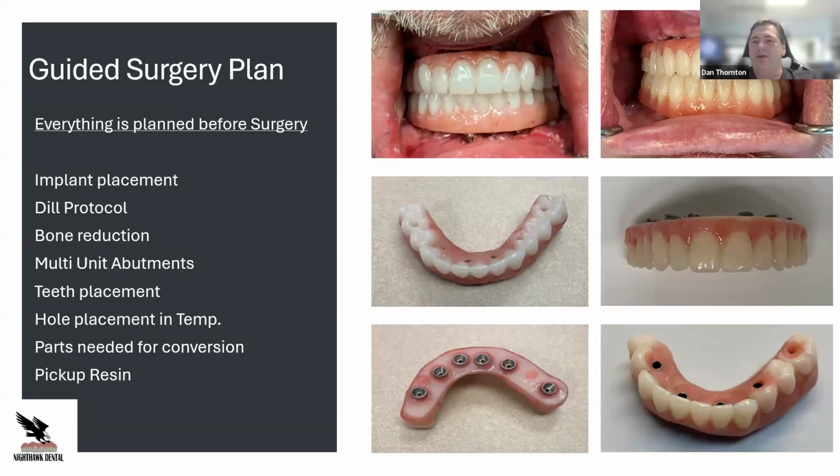Now, as you can see, what we like to do is, like I said, you get all the protocols when you're doing the planned surgery. You have almost a step-by-step guide. Are you going to be doing an already printed prosthesis? Do you want to do a smart conversion that clicks in? What material are you going to use? All this plays into it when you've got everything pre-planned from the stackable guides and also the predetermination of what we're going to do with that surgery.